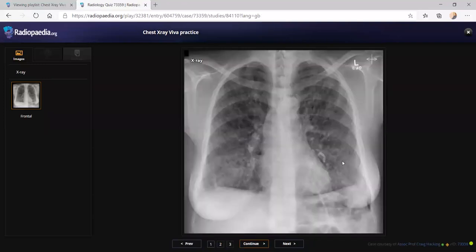Okay. And this patient had a previous pleural drainage for pneumothorax. So you started it correctly, like it's reticular shadows diffusely in the basal mid and upper zones with preserved lung volume in a female. So then you went to UIP. So that is contradicting your statement. So UIP will not have a preserved lung volume. So you have to think there are some cystic changes involved. That is, lymphangioleiomyomatosis should be your first diagnosis in a female. So you have to tell that you will compare the CT and previous film.